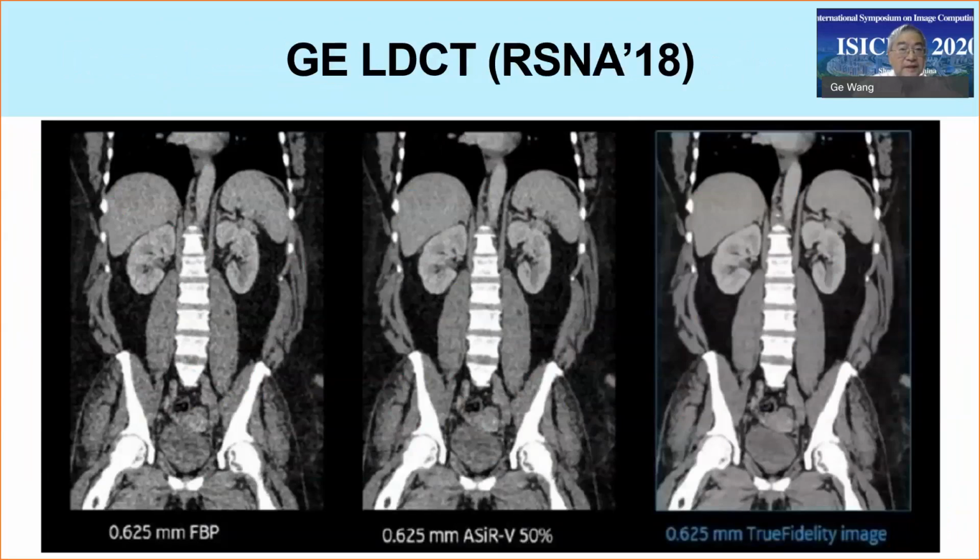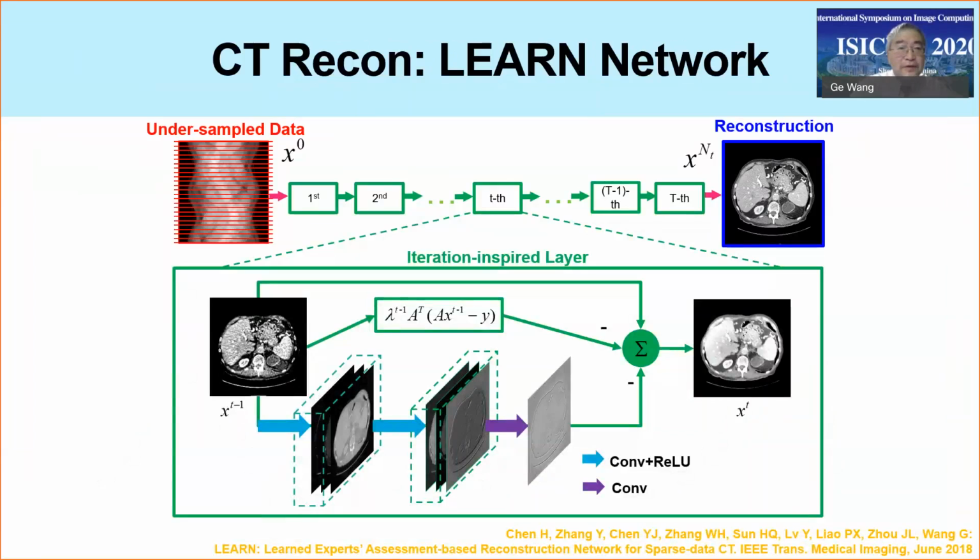The GE Global Research Center and Healthcare also work in this domain, and several years ago, they got FDA approval for deep learning-based image denoising. This kind of image denoising is still image domain post-processing. And how do we go from the sinogram domain to the reconstructed image? There are a number of good papers.